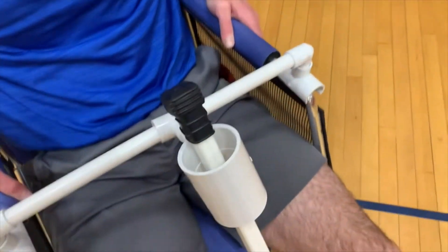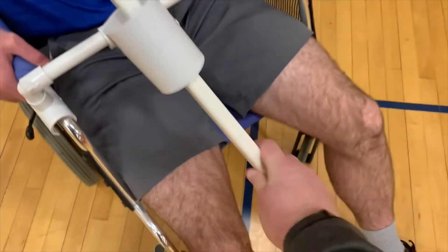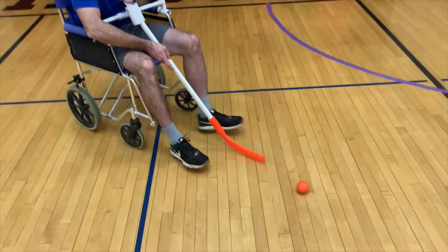The stick is held in by a piece of PVC, but it's a normal stick that you use for phys ed. It slides back and forth, and Scott will show us here. You can slide it back and forth and hit the ball with it.